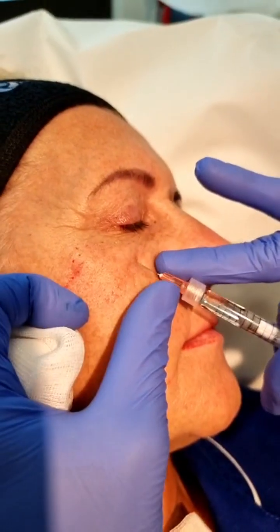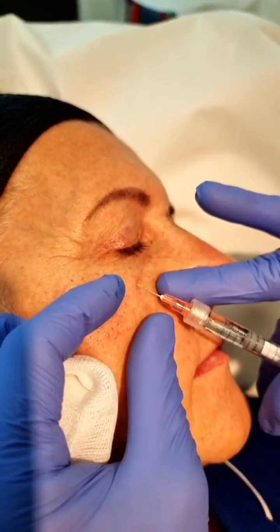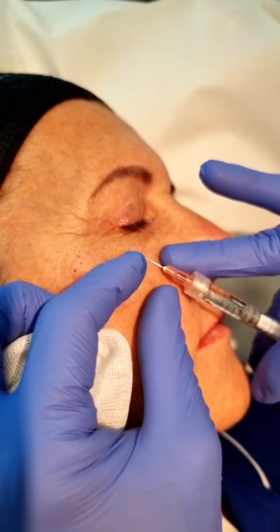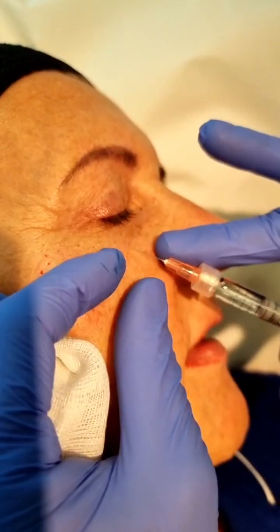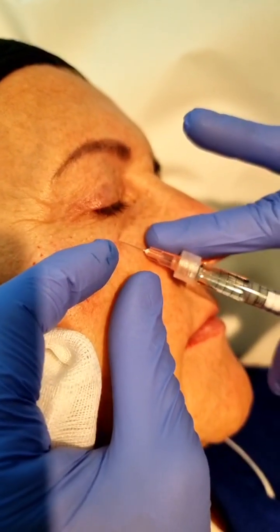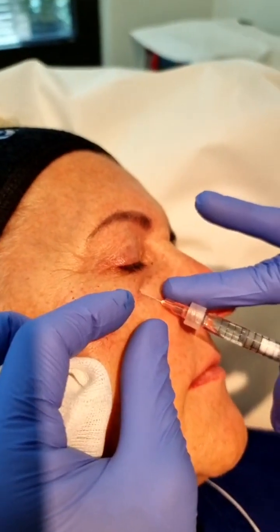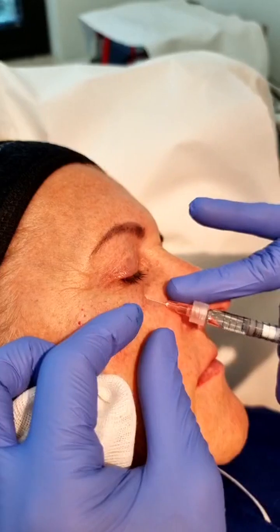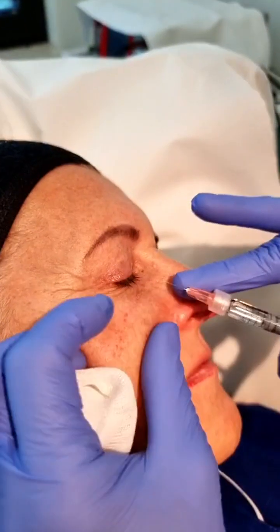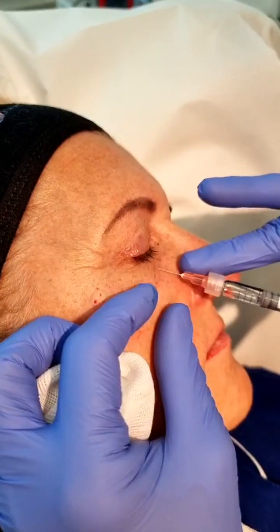But since the skin is very thin, I always advise to do it again a second time after 3 months. Because the Restylane which is in the skin will make the skin react with producing more collagen. And the extra collagen is what you actually want, because that's rebuilding the skin. The extra collagen is far more interesting than the gel itself, the filler. We don't care about the filler, you know. The skin is to be remodeled and restored.